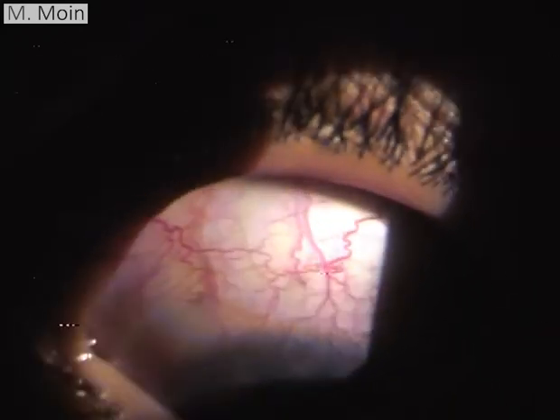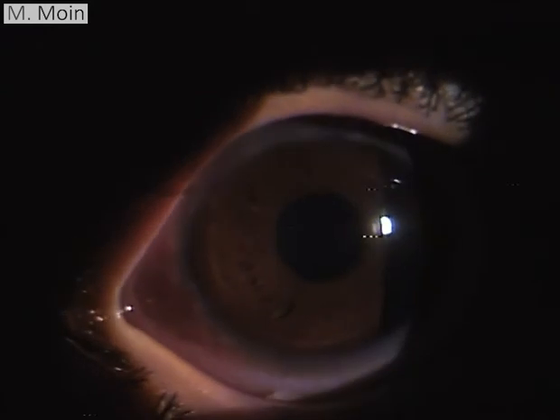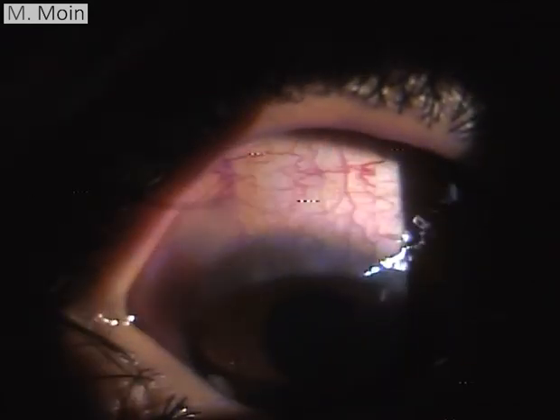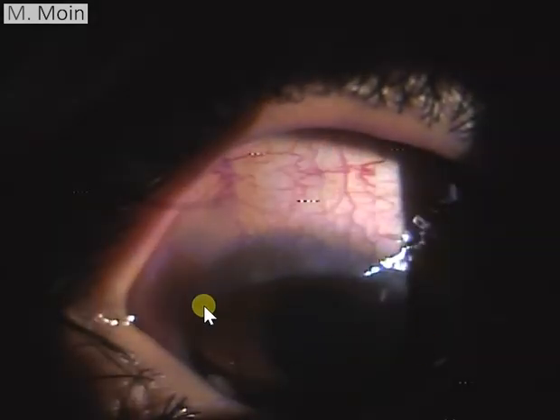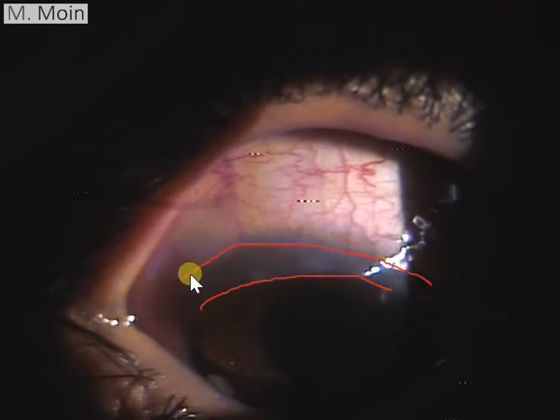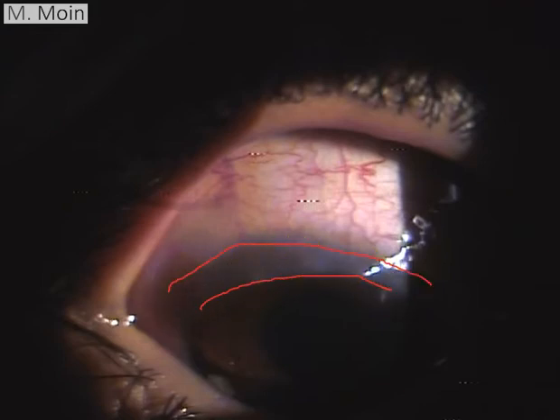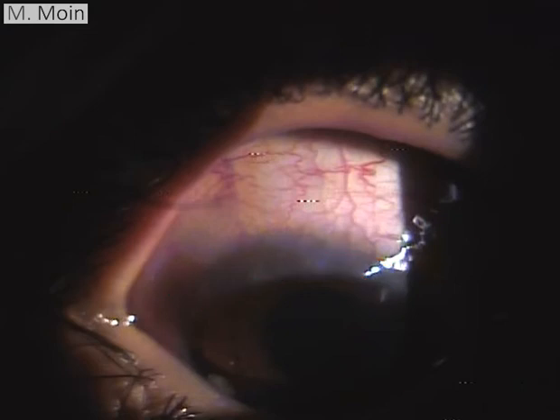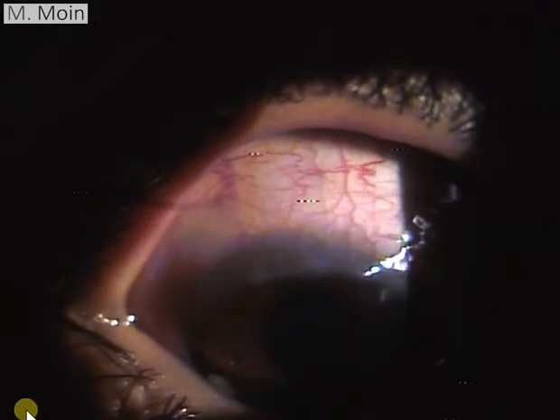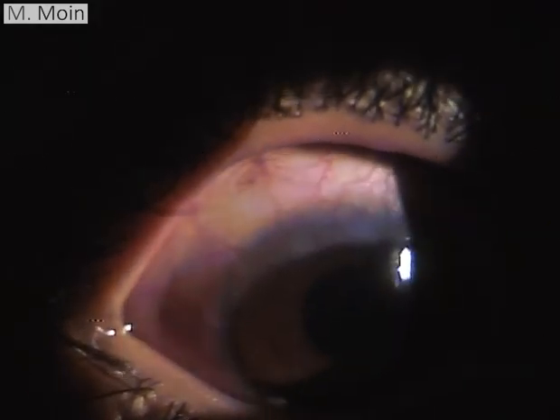You can see this area of congestion and the area of limbal whitening which I was mentioning as pseudo-gerontoxon. This is an area of vernal keratoconjunctivitis where you see Trantas dots in these patients.